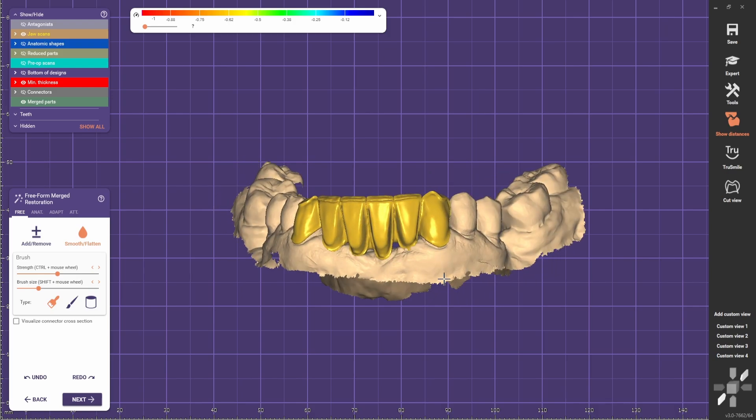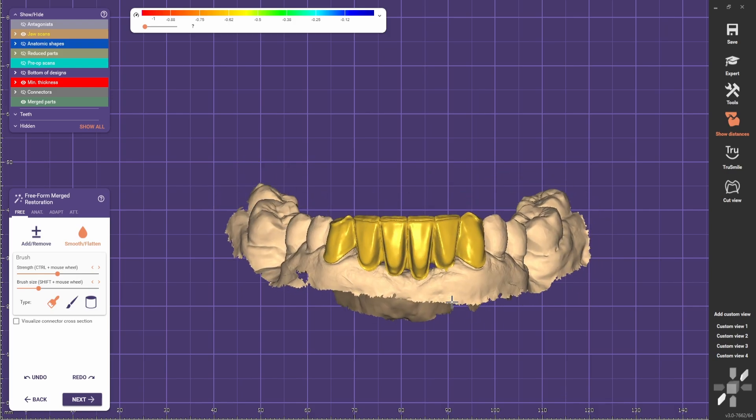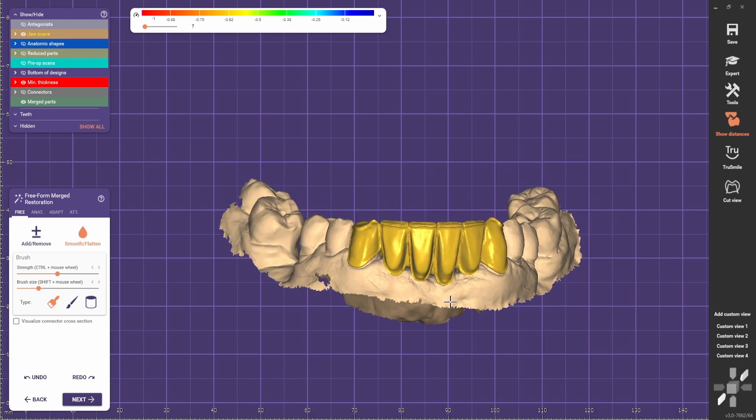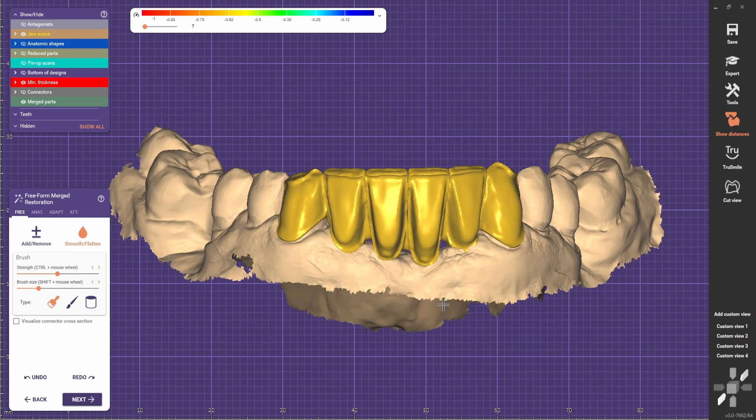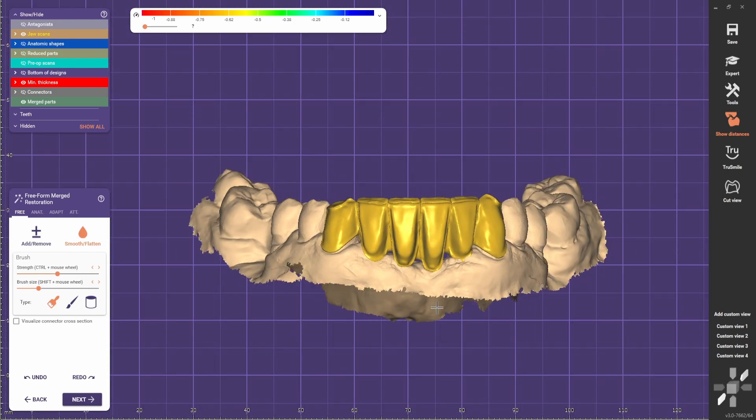And it is done. A buccal cutback for layering porcelain.